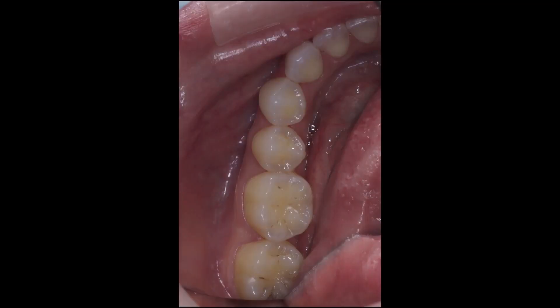A light stream of air from an air-water syringe prevents fogging and unclear images. As you can see, the resulting untouched occlusal mirror-reflected image with retraction in place gives me a full view of the tooth in question as well as the surrounding dentition.